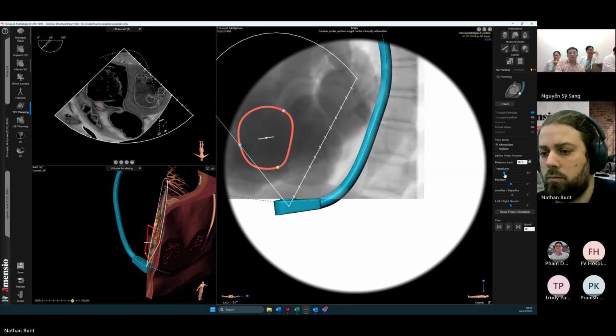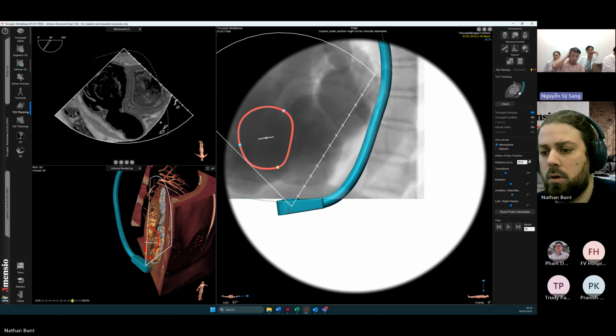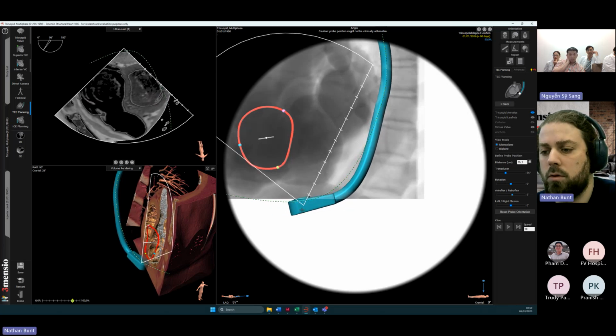You could also try to go for more of a fast view, as it were.